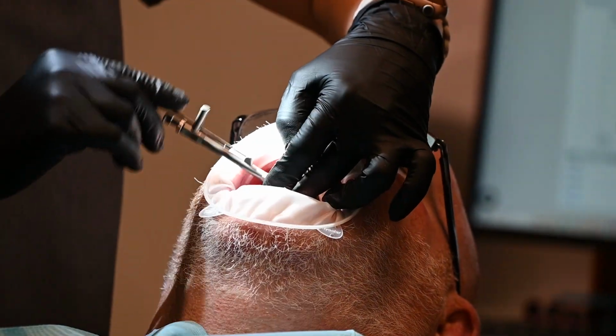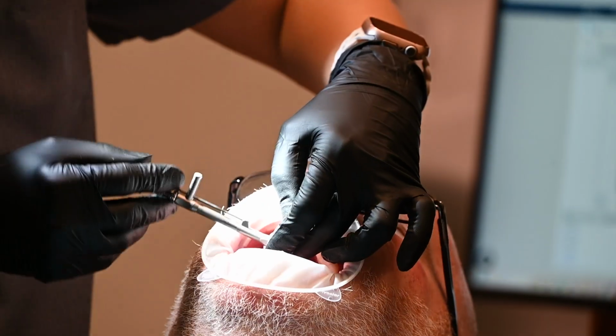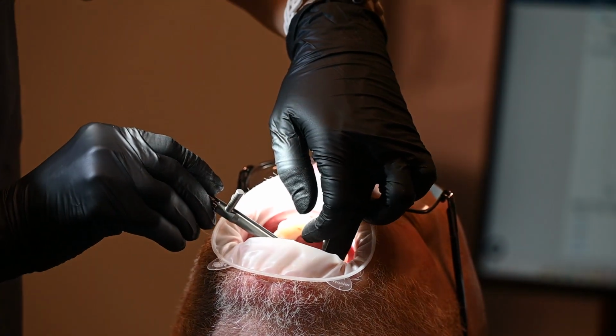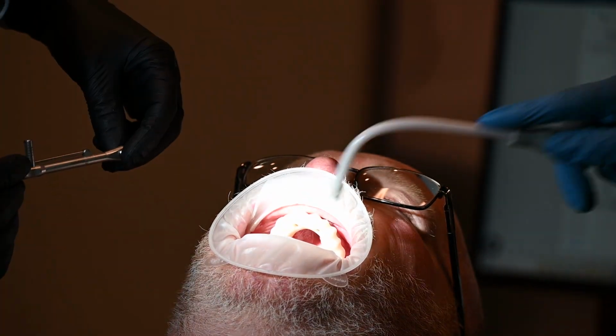Then once we scan everything and have the proper design, we can print the design here for a provisional restoration, right? That provisional restoration is highly biocompatible. It's made out of very aesthetic resins that are very durable for this transitional phase between something provisional and something final, right?